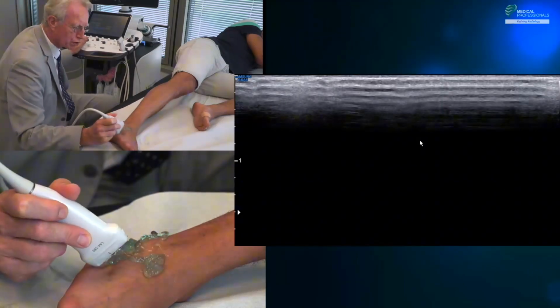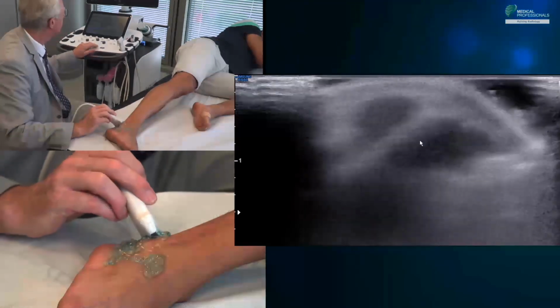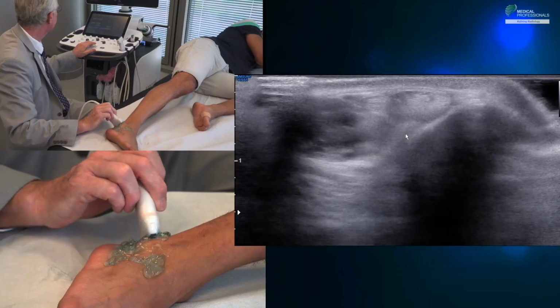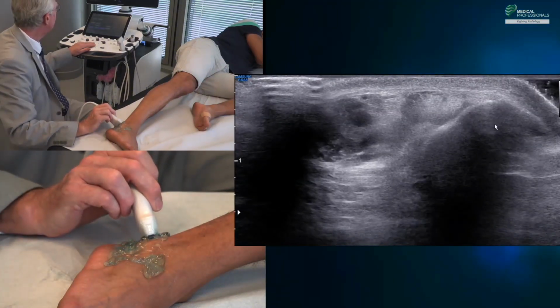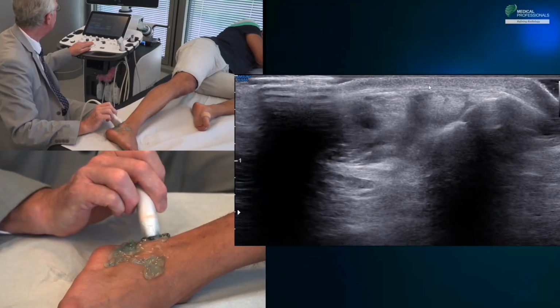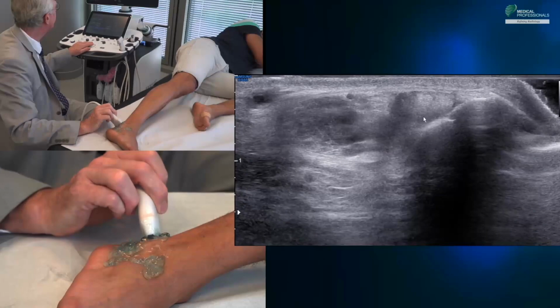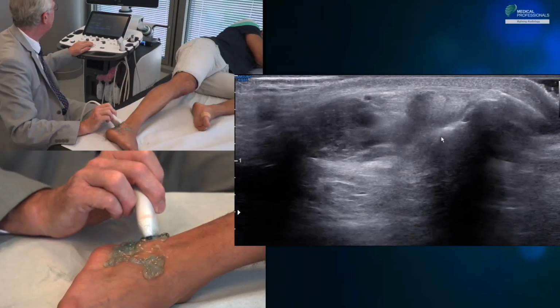But there are other structures that must also be looked for, specifically the peroneal tendons, where peroneal tendon pathology is extremely common. It is divided into two parts. Initially, there is retromalleolar pathology. In this pathology, there is often an impingement between the compartment of the peroneal tendons and the lateral malleolus. What do we look for at this level? We need to look for three things.